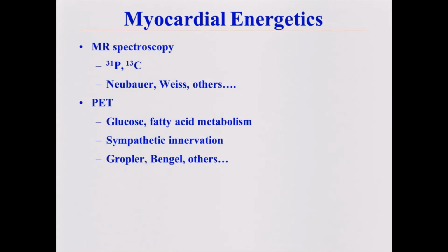And then PET, of course, remains a phenomenal technique to study both glucose and fatty acid metabolism, also sympathetic innervation. And again, anyone interested in this, I'd point you to work from Rob Gropler's group at WashU and Frank Bengel's group.